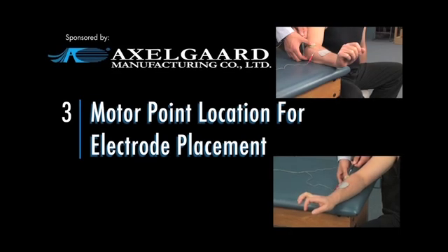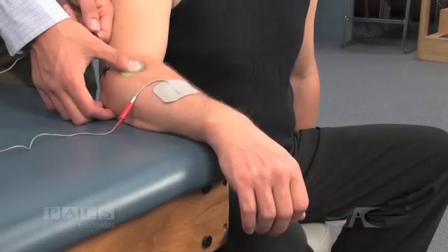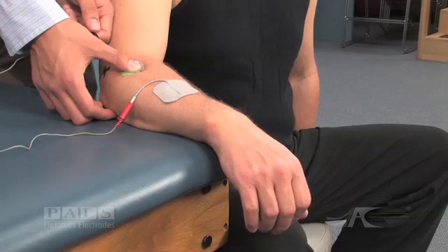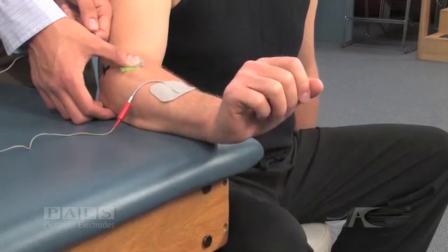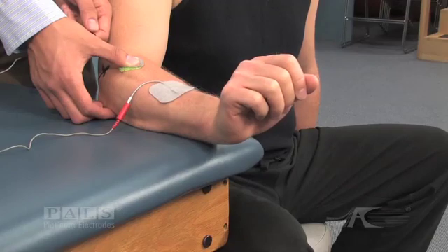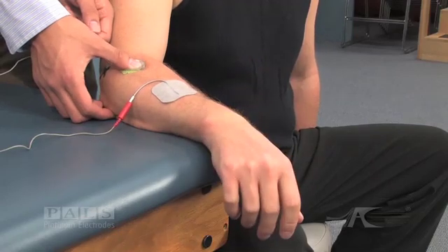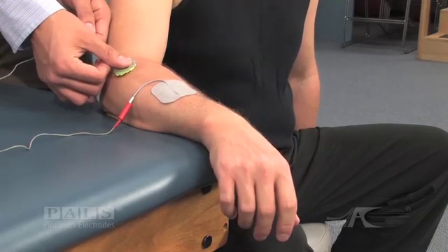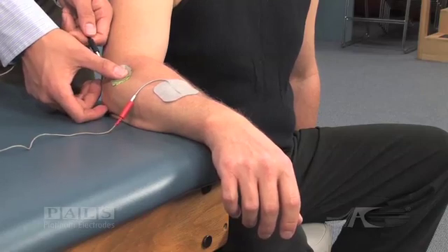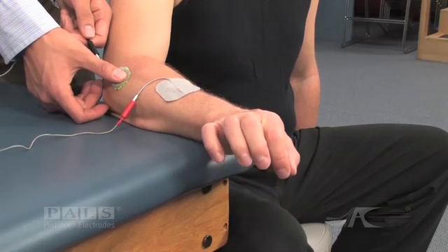Motor Point Location for Electrode Placement. Electrode placement is critical to the success of the stimulation treatment program. In order to identify the best possible electrode placement, the electrode itself may need to be moved multiple times. This is particularly true in the small muscles of the forearm and the lower leg.